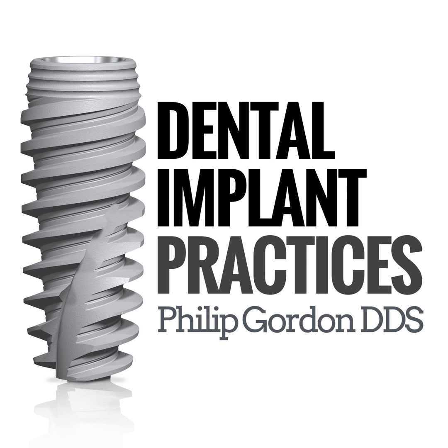And then offering alternative treatments to patients, the 2 implant solutions for the mandible with locators, at least getting them started. And maybe their financial situation will change in the future where I tell patients we can add 2 more legs to the table and then we can make it fixed. And that's what we did with the Hahn implant. We try to price it to make it affordable.